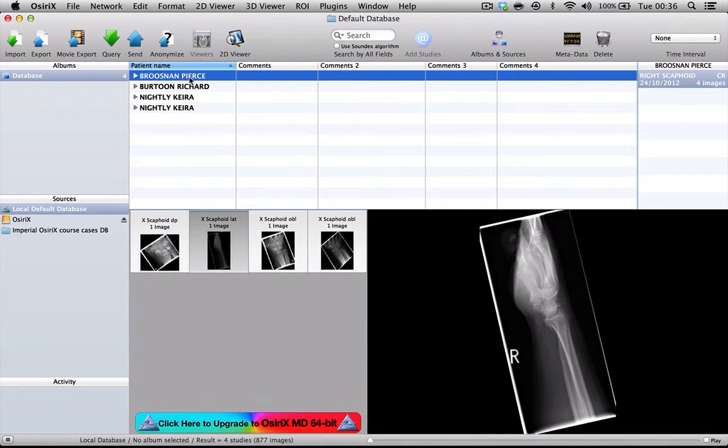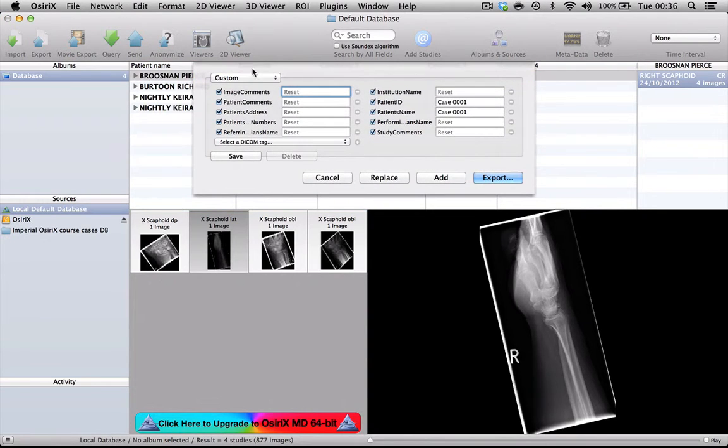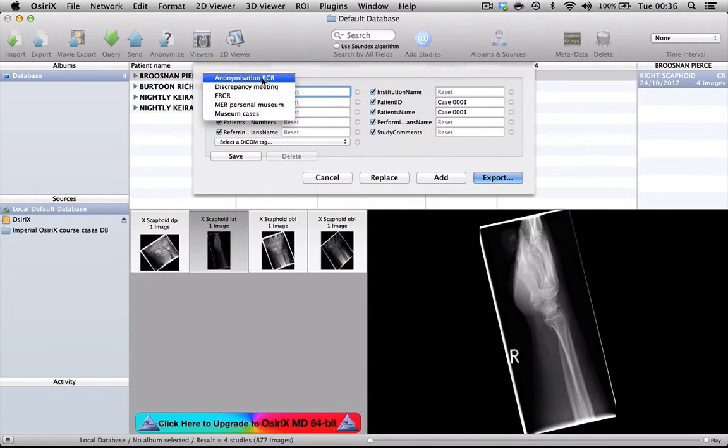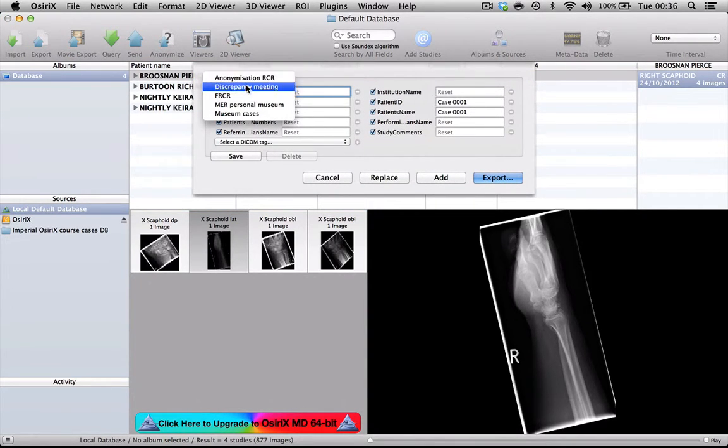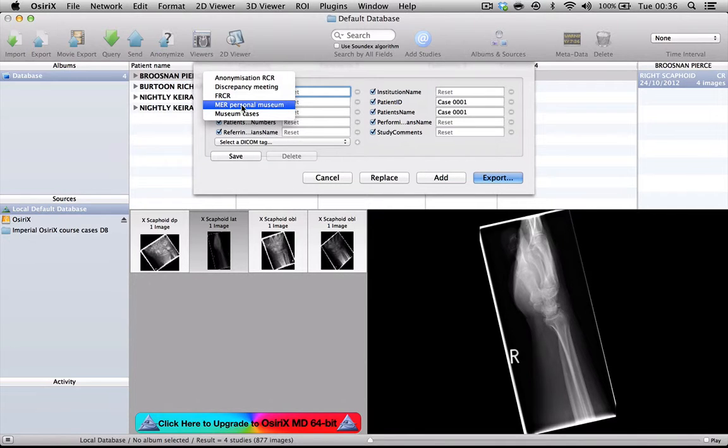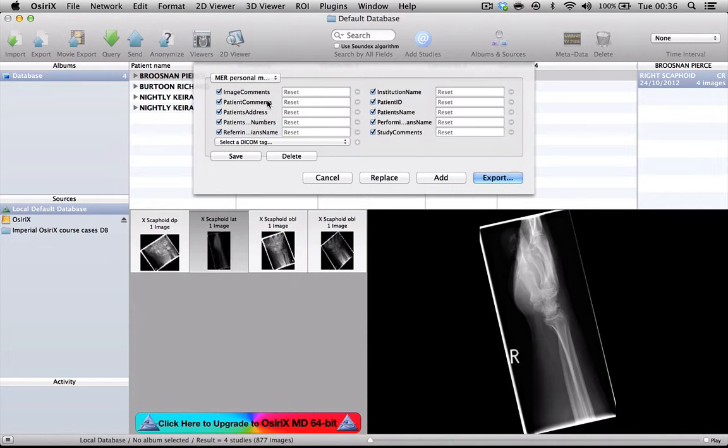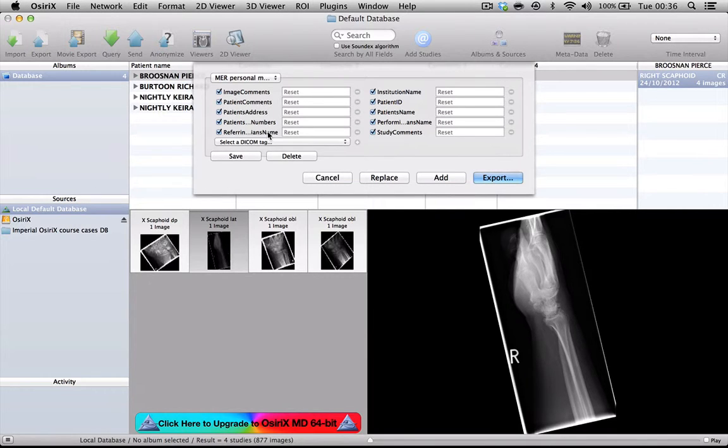If we look at this first patient here, if I press anonymize, I'm going to get a list of different default anonymization protocols that I have previously set up. I'll select 'MER Personal Museum' here. You can see that what this does is it's selected a different number of DICOM headers which will be stripped if we press the anonymization button.